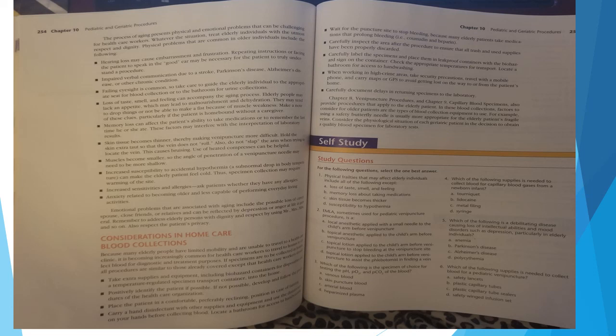Place the patient in a comfortable, preferably reclining position in case of fainting. Carry hand disinfectant and other supplies and equipment, and use the disinfectant on your hands before collecting blood. Locate a bathroom for access to hand washing. Wait for the puncture site to stop bleeding because many elderly patients take medications that prolong bleeding. Carefully inspect the area after the procedure to ensure that all trash and used supplies have been properly discarded. Carefully label the specimens and place them in leak-proof containers with a biohazard sign on the container. Check the appropriate temperatures for transport. Locate a bathroom for access to hand washing.